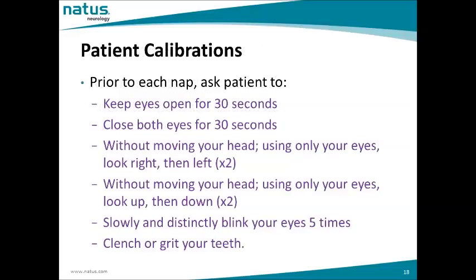Prior to each nap, ask the patient to keep eyes open for 30 seconds, close both eyes for 30 seconds. Without moving your head, using only your eyes, look right and then left 2 times. Without moving your head, using only your eyes, look up then down 2 times. Slowly and distinctly blink your eyes 5 times. Clench or grit your teeth.